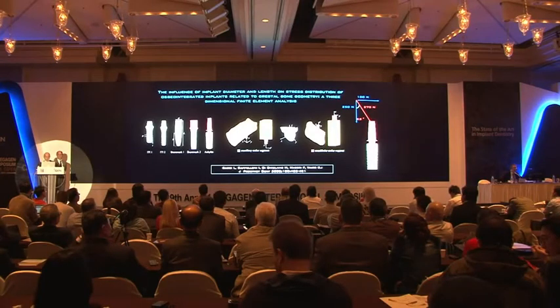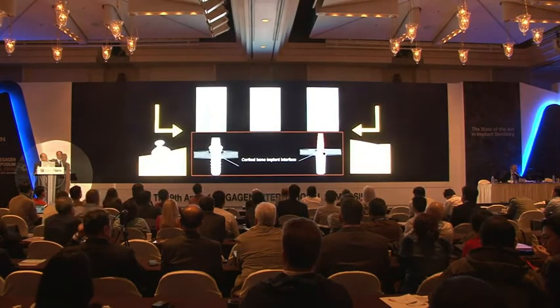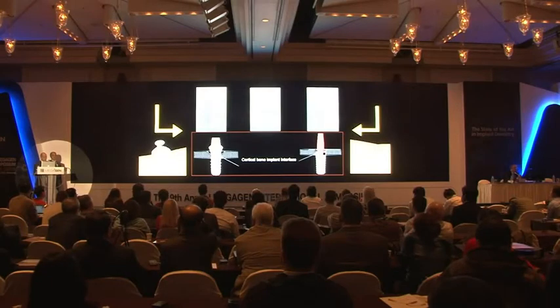We did this comparison with a finite element analysis study. We designed different bone interface conditions, one with bone on the platform and one with a cone of resorption.